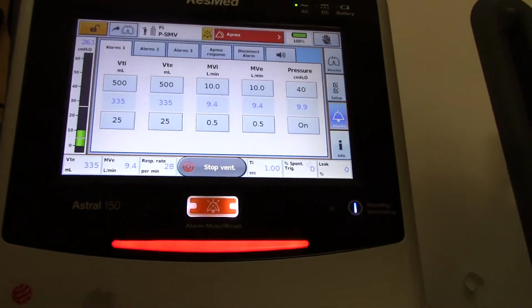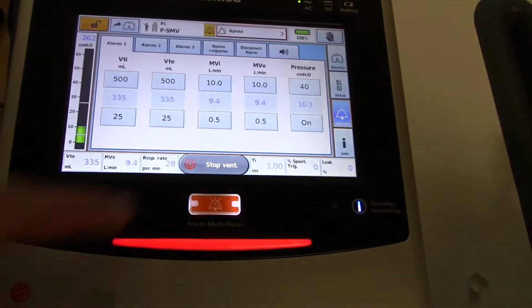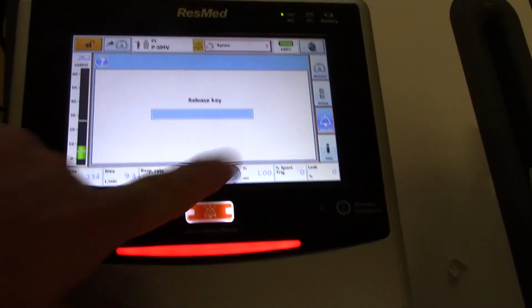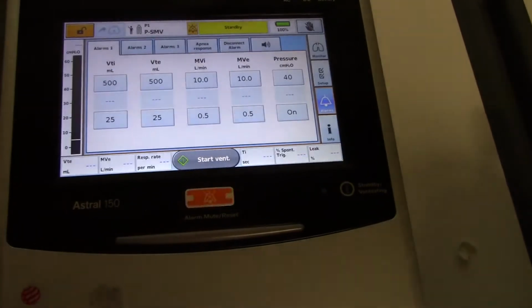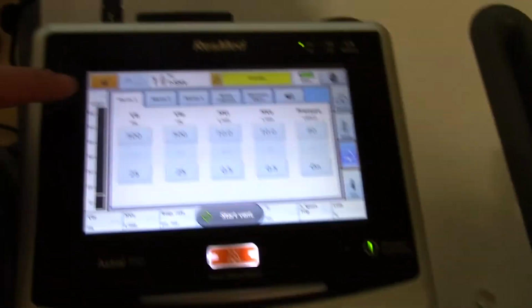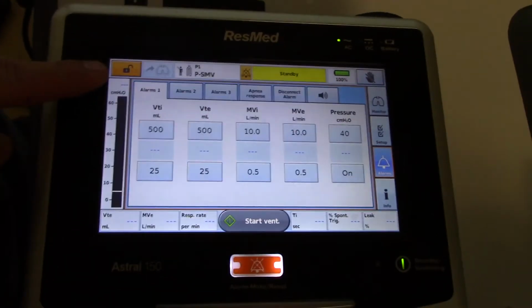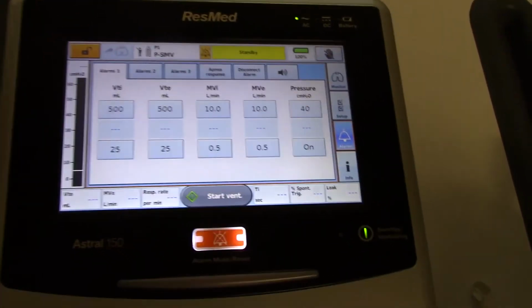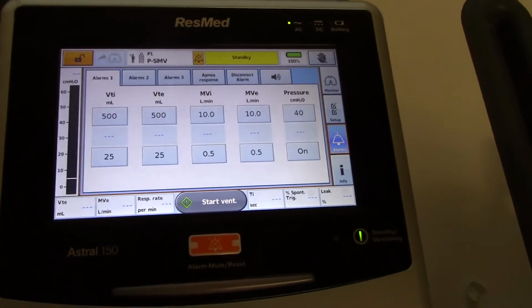To stop ventilation, you're going to have to hold this for 3 seconds, release the key, and then confirm to put the vent on standby. Again, this top button has to be unlocked for any of this to happen. Any time this is locked, it's not going to let you change settings on the screen.